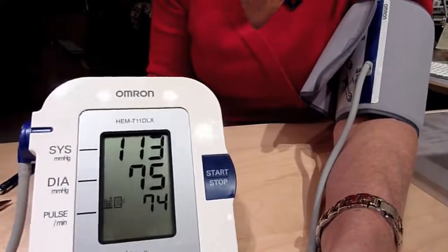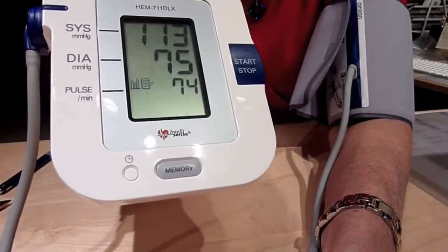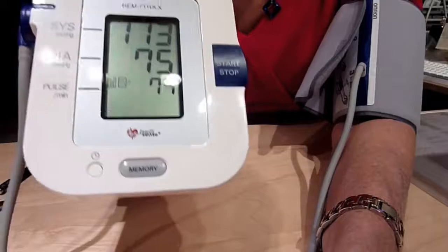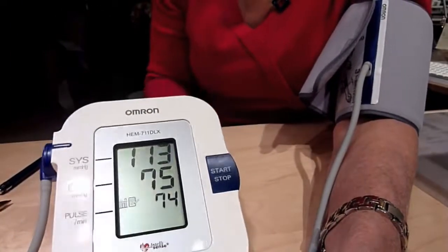So that's the model and that's how easy it is. That's the OMRON HEM-711DLX Automatic Arm Blood Pressure Monitor. Thank you.